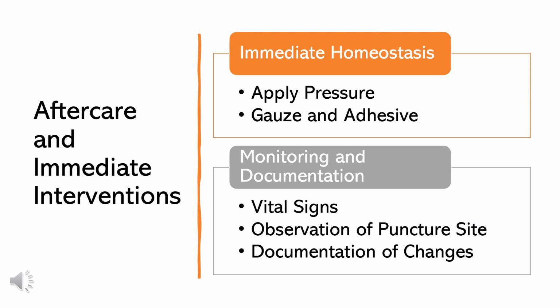Once the ABG has been collected by the healthcare provider, your responsibilities as a nurse transition into critical aftercare. The following steps are crucial for ensuring patient safety and data accuracy in the immediate post procedure phase.